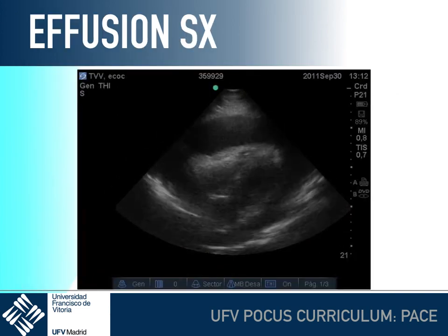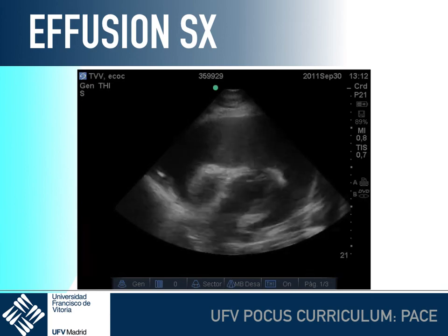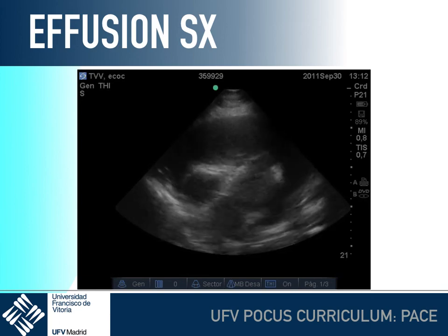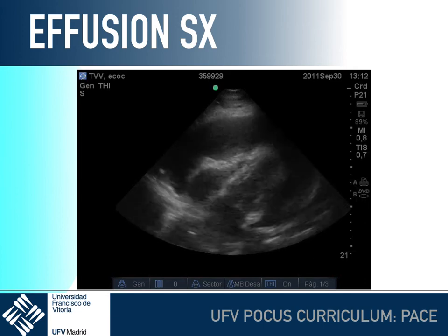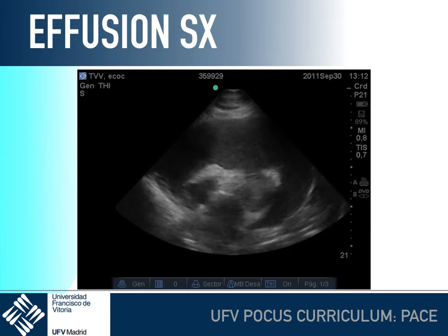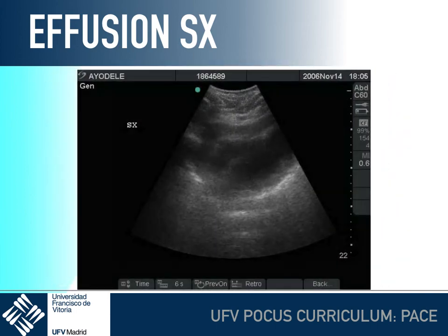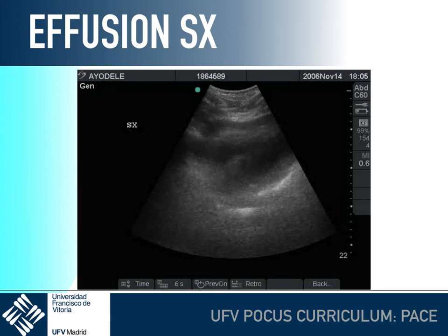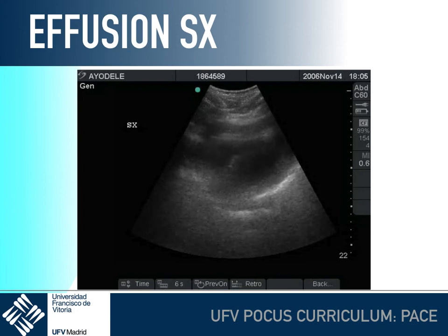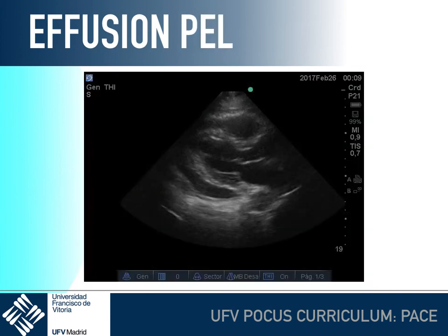What does an effusion look like? Like this. There's a lot of fluid around the heart. The heart actually is swinging inside the pericardial sac, but this is a really large effusion. Medical problems in terms of tamponade can occur even with really small amounts of fluid, up to 100 milliliters.